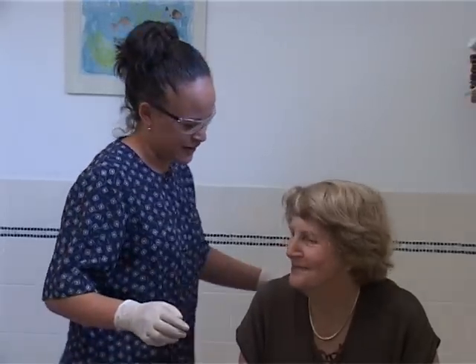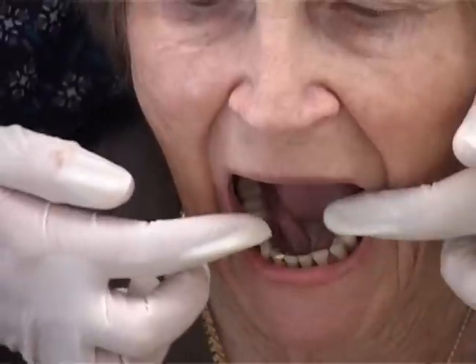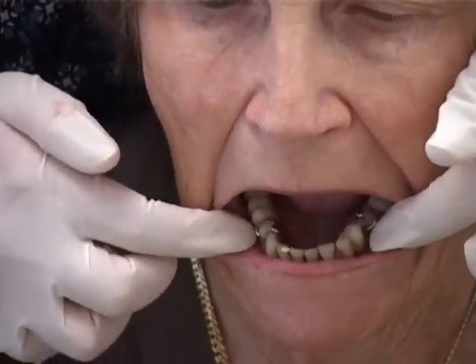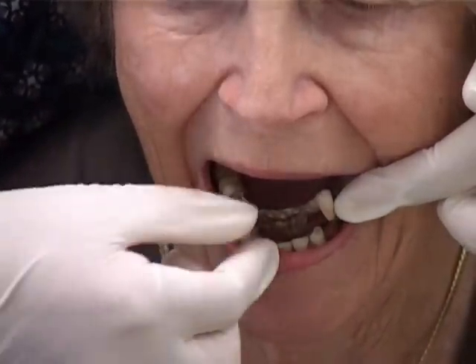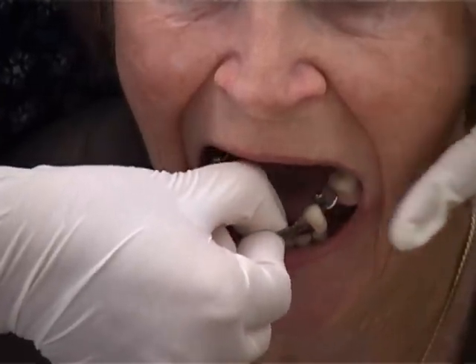Partial dentures are held in place with small clasps that cling onto natural teeth. Some are looser than others. You may need to put your fingernails under the clasps on each side of the mouth to lift the denture out by applying pressure to the clasps.